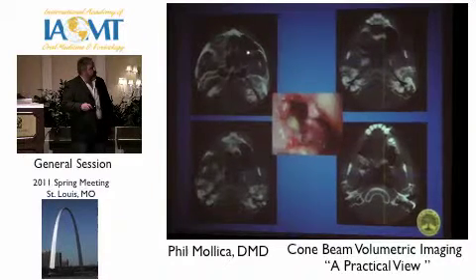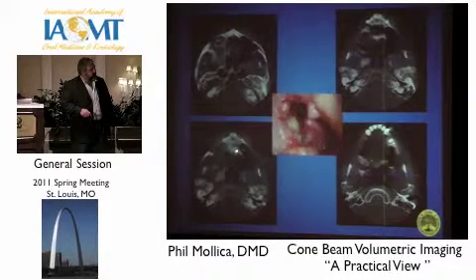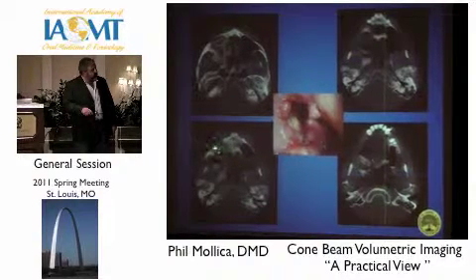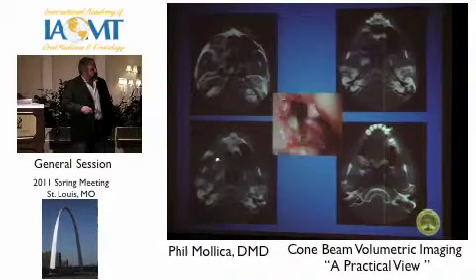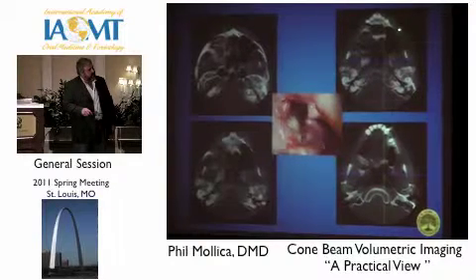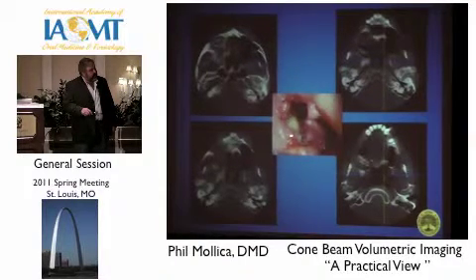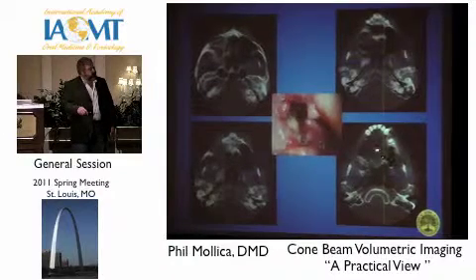As we work our way down, we're up high, working our way down, we see the first remnants of the maxilla. Once again, we still see the maxillary sinus. We see some turbinates here. But once again, this is obliterated. Okay? All inflammatory tissue here blocking in. We're working our way down inferiorly. Once again, we start to see the root tips of the maxilla itself. And we're working our way into here, which is really representative of this void here. So you can do a correlation.